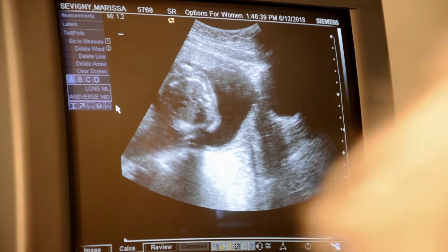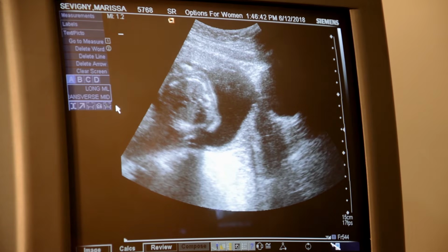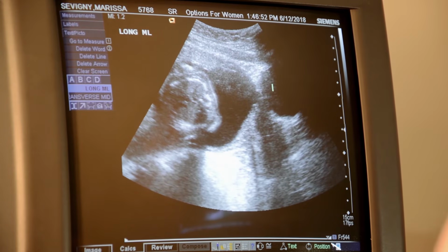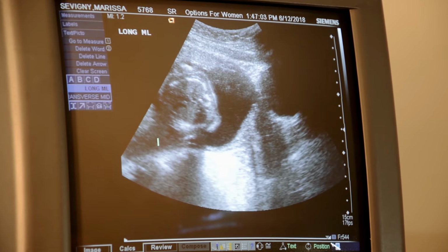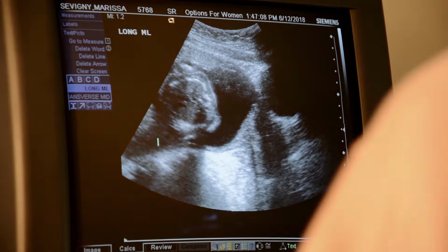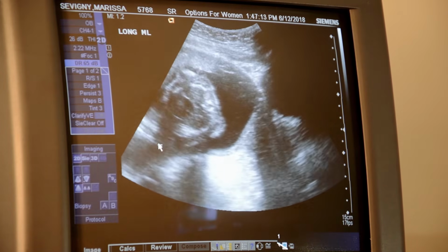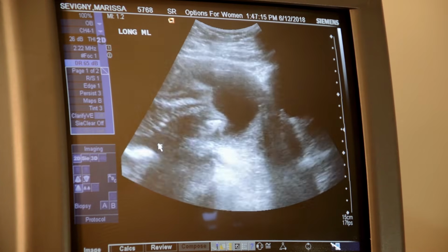Okay, that's very nice. Right here, she's got my lower bladder. Okay, go ahead and freeze that. Okay, what do you think of that? Do you like that? That's called her lower sagittal midline. And I don't know if the annotate's working or not. We were having problems before. Now it's working. So here's her bladder. Here's her vaginal canal. Here's her cervix. And here's the lower uterine segment. So we'll just go ahead and take that. And that would be this one, yeah.